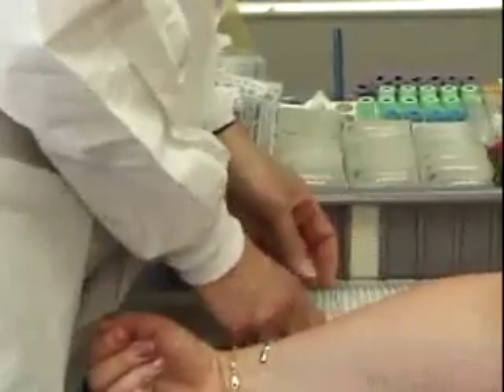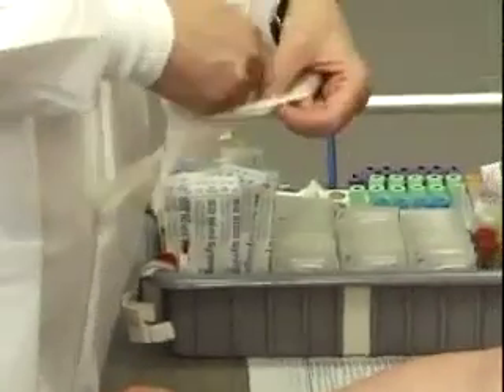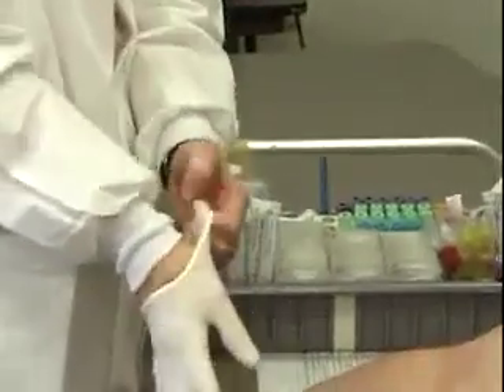I'm going to put my gloves on. You notice I do not have to put my gloves on until I actually get ready to do the stick.